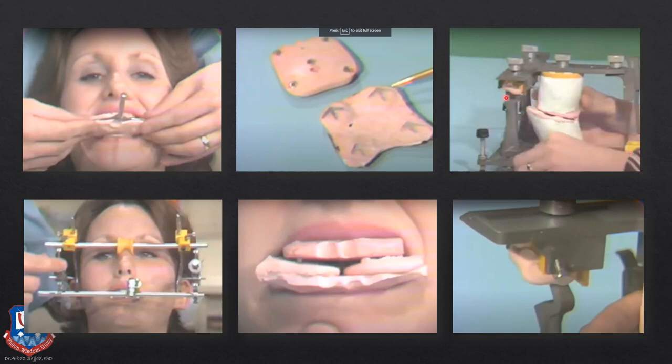So this is done by placing acrylic in the sleeves of the condylar guidance, and when the acrylic is in the dough stage, using these records, the operator does forceful protrusive and laterotrusive movements, and depending on the shape of these interocclusal records, the horizontal condylar acrylic custom guides are prepared. And after this, the horizontal, the lateral, and the incisal guidance are set.